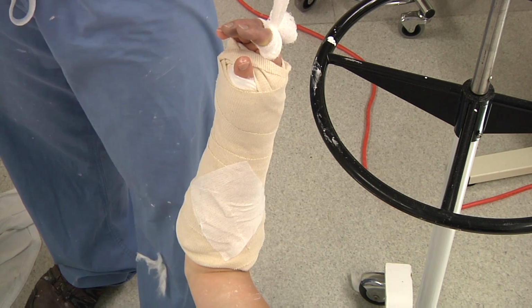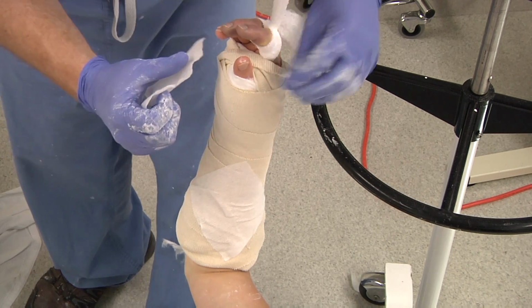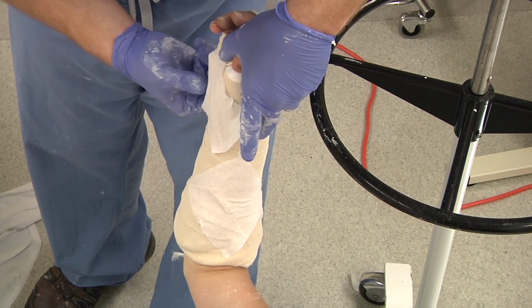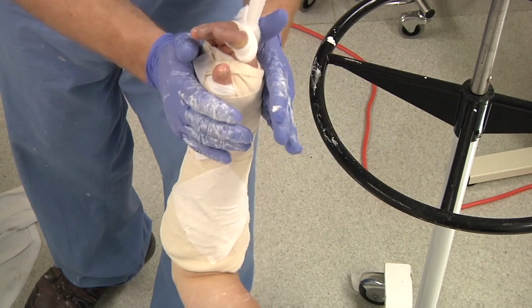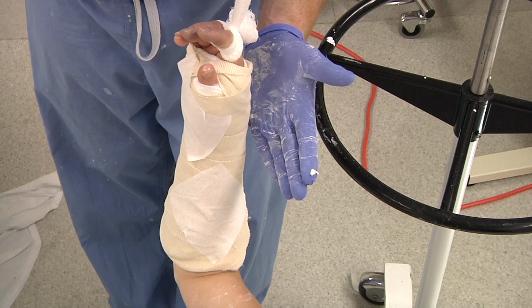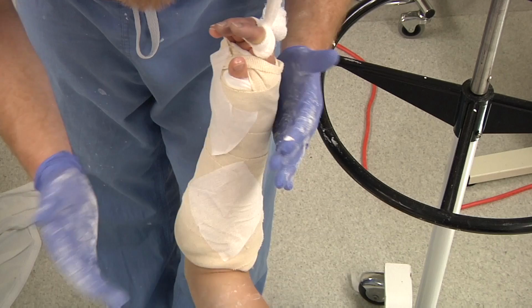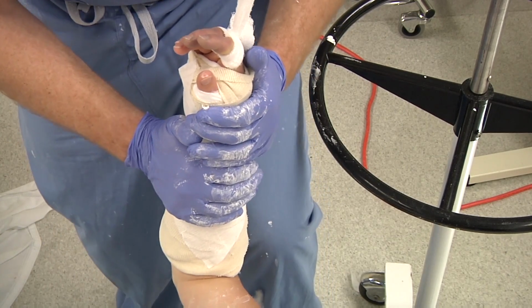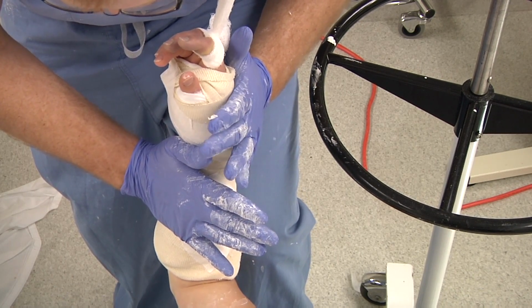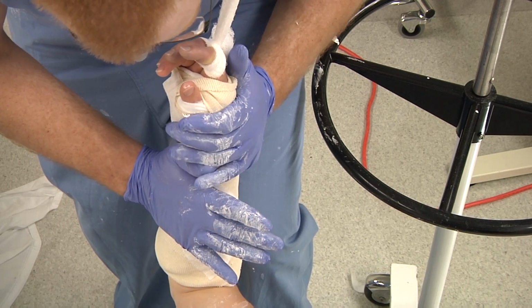And from here, if you need to do any reductions, this is the time to do it before your plaster gets hard. So if you're doing a distal radius reduction, we use ligamentotaxis, we've got our traction pulling up, push on the carpus to reduce your fracture in the appropriate direction after reviewing your radiographs. If you need even a little counter traction at the bottom, that's very simple to do. We're using the carpal ligaments to reduce any fractures as long as they're intact.